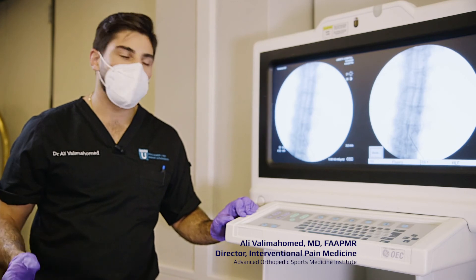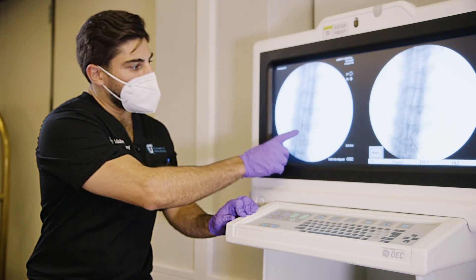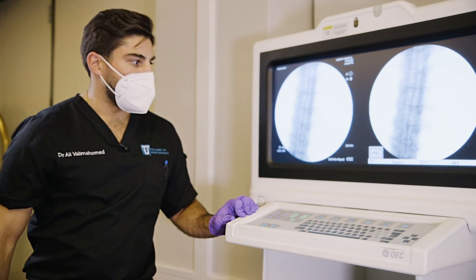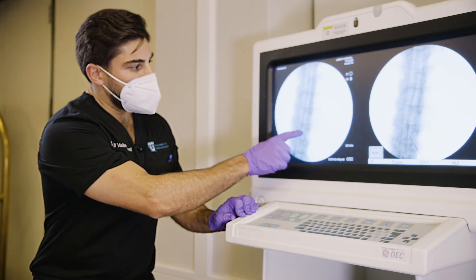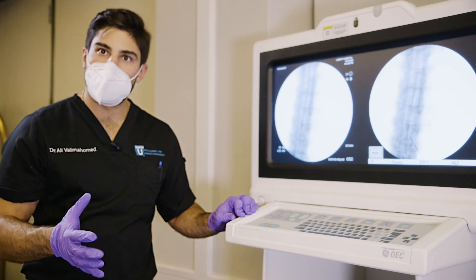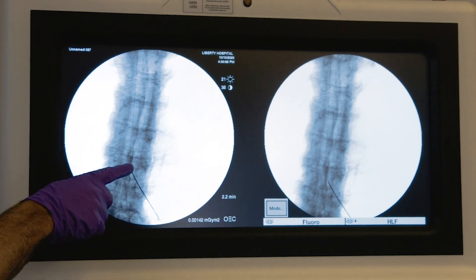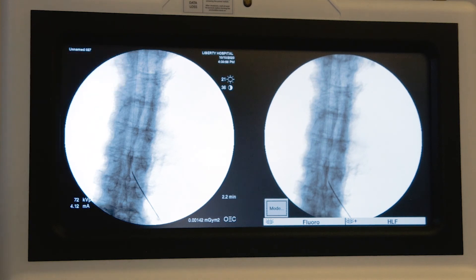Many physicians are intimately familiar with the bony landmarks seen on fluoroscopy. Centrally you have the spinous processes, and more laterally you have the lamina and the interlaminar space. Using the Acuro epidural guidance system, you can find and locate the lamina, and then using the needle guidance system, you will land the needle onto the lamina. Then using your typical walk-off technique, you'll walk the needle into the interlaminar space. Using loss of resistance technique, you'll gain access to the epidural space and then be able to thread your catheter cephalad. Here you can see successful placement of the catheter inside the epidural space.